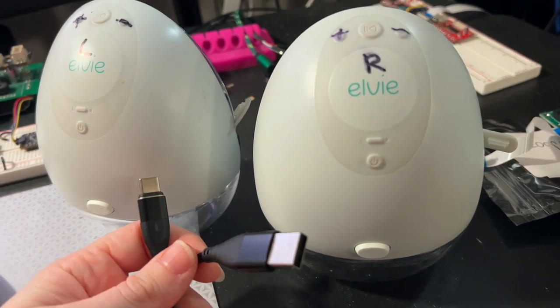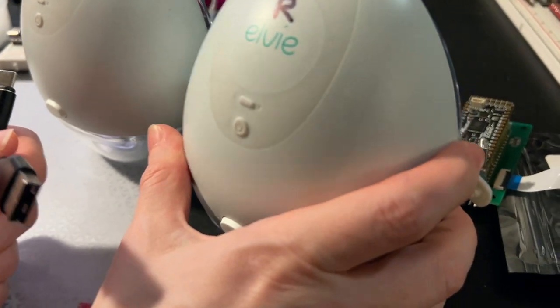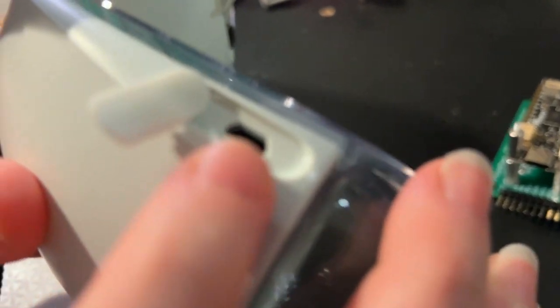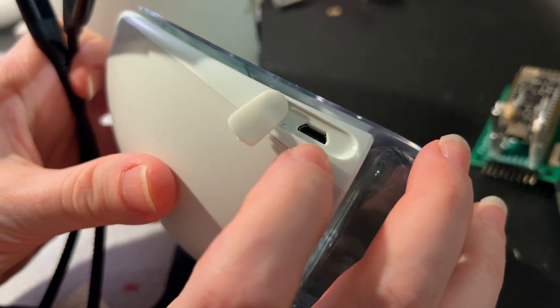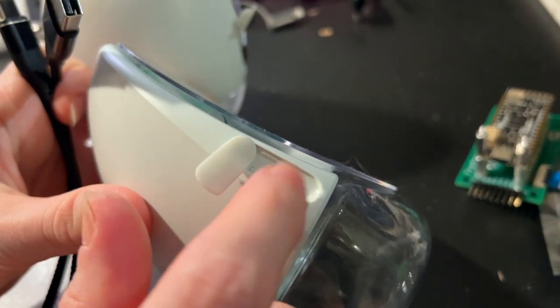Hi Lady Ada, what's this? I just want to show a tip that might be helpful for other people who are using LV pumps. I really like these portable pumps but they use a micro USB port to charge, and you have to charge them at least once or twice a day — sometimes even more depending on how often you pump and how long.